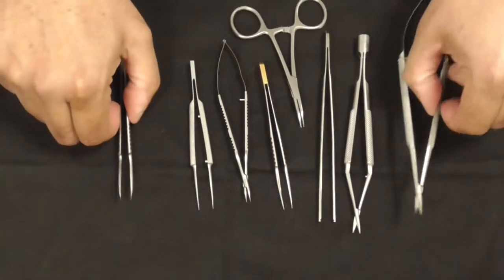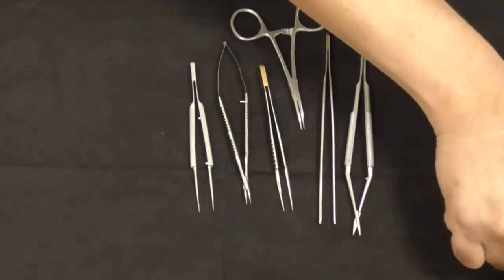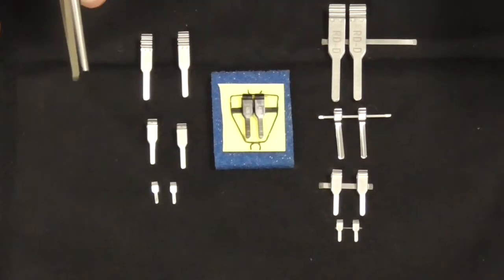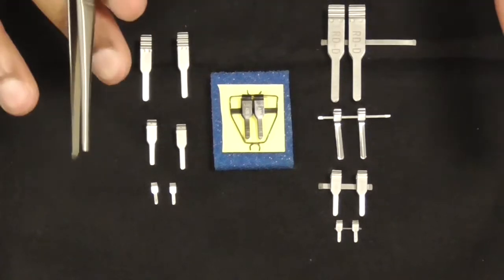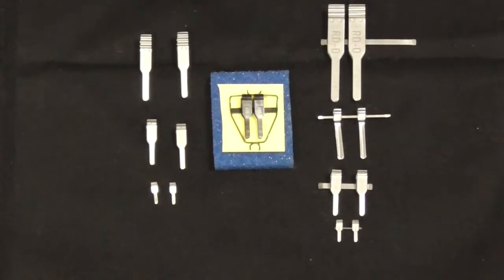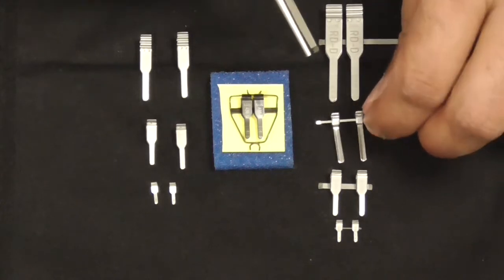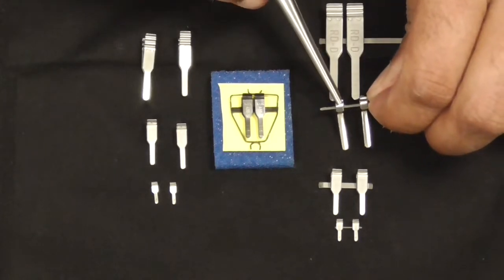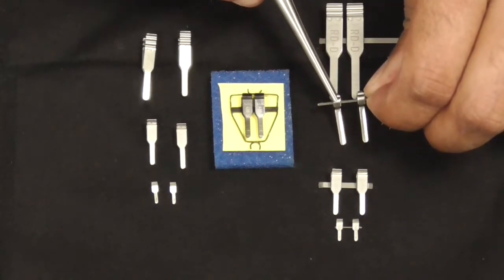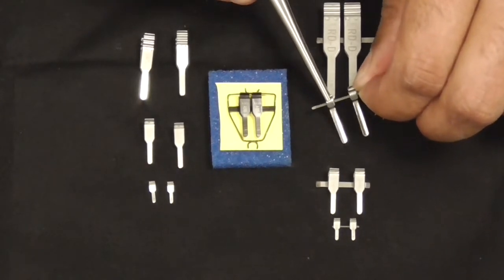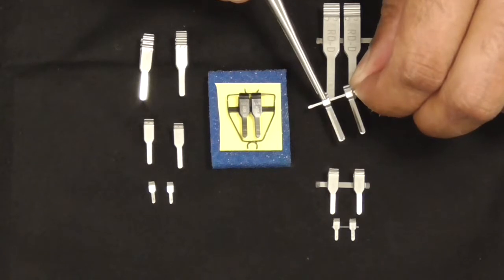So we're now going on to the microvascular clamps. The features all these clamps have in common is that they're non-crushing clamps and quite delicate instruments. Most of these, with the exception of the really big ones, need the clamp applicator to open and close. You can see the clamp applicator fits like that and opens and closes the clamp.